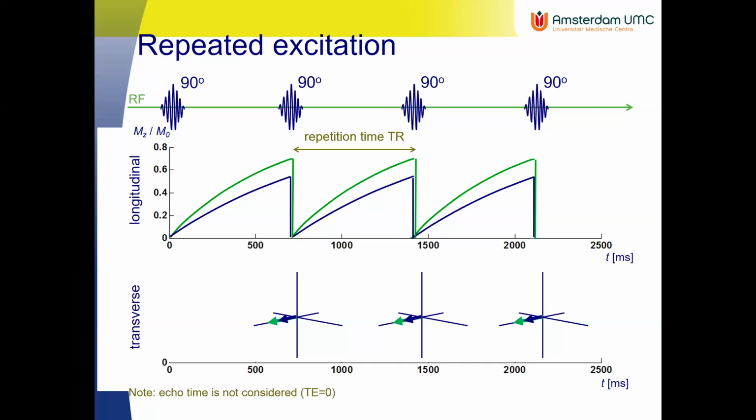It is just that we think of the T1 and the T2 relaxation and the detectable signal in the transverse plane, which makes it really useful to think about. So we always split up the two components, but in reality, what the spins would experience is the net add up of those two components, obviously.